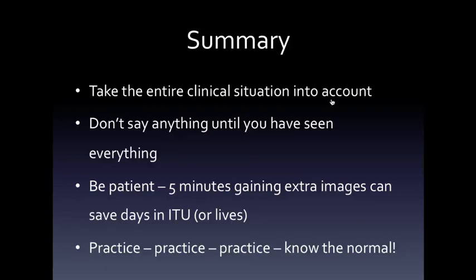You don't actually have to marry them, but you could if you do. But the idea is that the echo machine is an integral part of the intensive care unit, so I don't have to go down and get the thing up. We all work together, and our fellows would be involved in taking images of the unwell patient. You know, nothing like, let's have a look at the echo. And that's what's become the norm in a lot of units I work in, and I think it's a great thing.